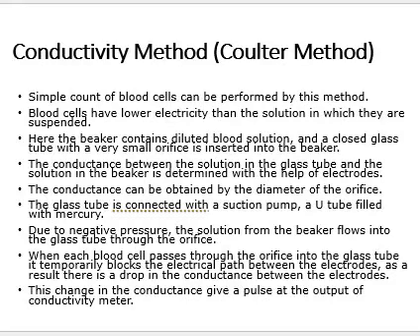Okay, so the number of times it is turned off can be counted here. That is why it is called the Coulter method. Here there will be an arrangement for the current flow through the apparatus, through the apparatus with a small hole.